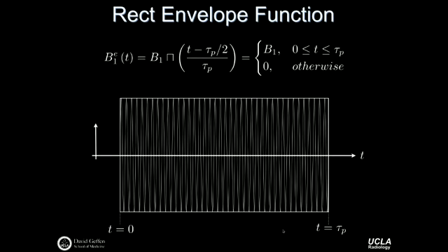What it means is, let's say you have a very uniform phantom placed inside the scanner, and you use a Rect pulse to excite things. In ideal circumstances, all protons have the same resonance frequency, your radio frequency pulse has a single resonance frequency, and you just match those two frequencies, and you can excite everything in the object of interest. And so these are oftentimes used for what we call global excitation pulses, if you just want to excite sort of everything at the same time. We'll talk more specifically about slice selective pulses a little bit later.